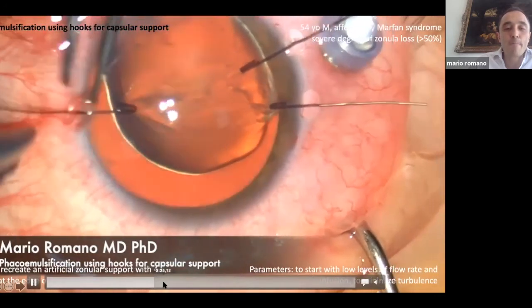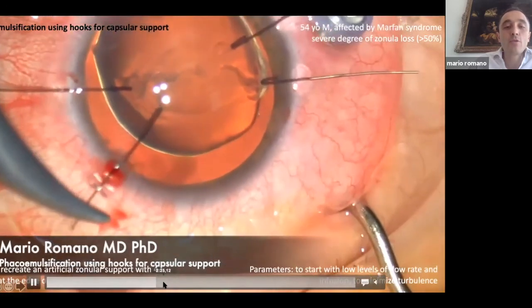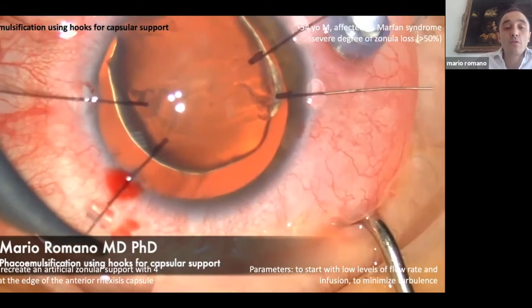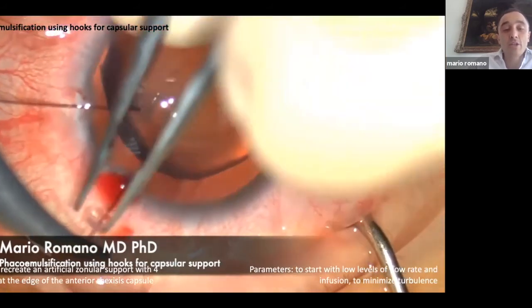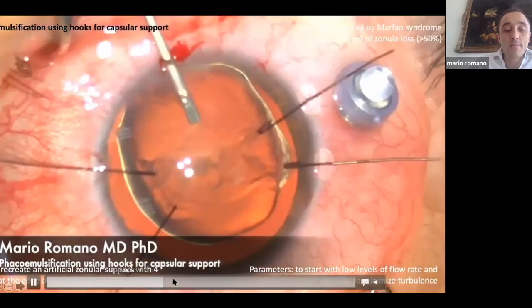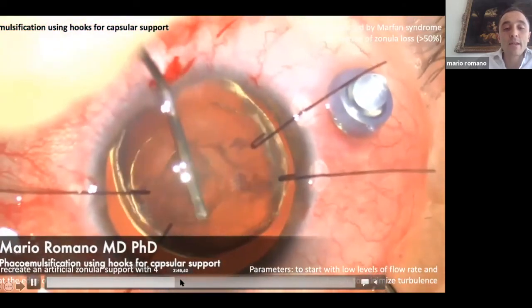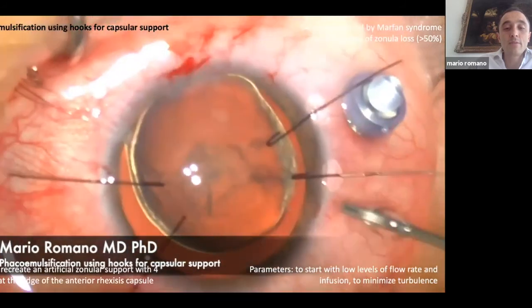And the aim is to avoid dropping the lens down and to induce a further traction on the vitreous space. And then doing the hydrodissection several times in order to be sure.